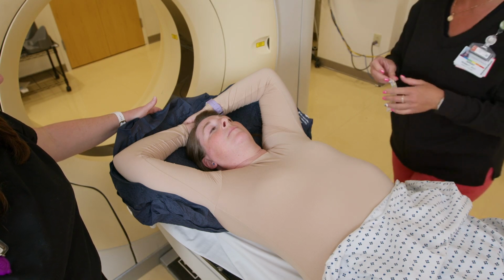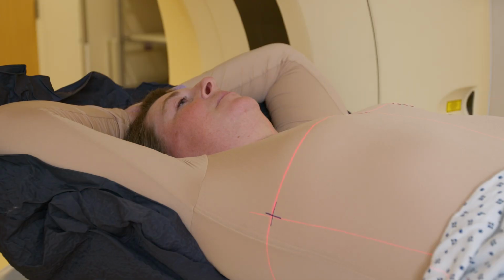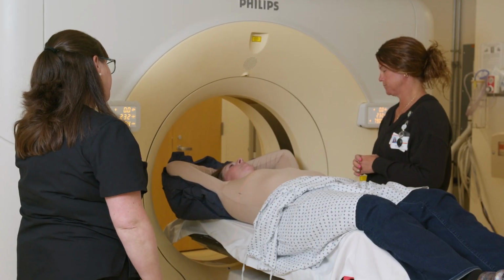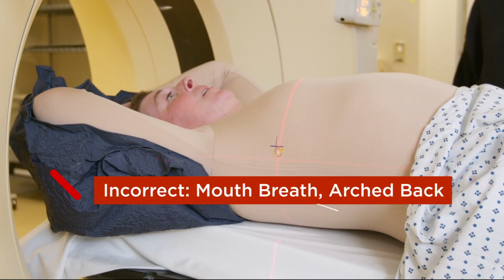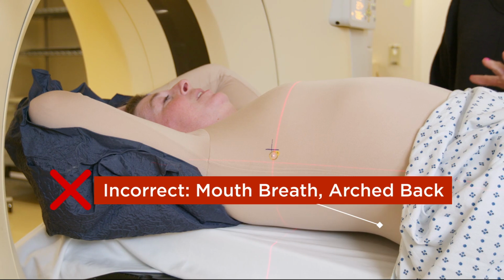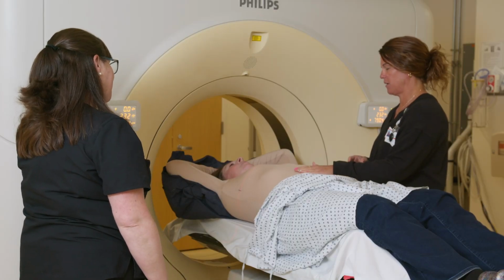Once you're in the best position for your body, you'll be coached on the breath hold technique. We'll start with a little practice. You'll be guided to take a deep breath in through the nose and hold without arching your back. Our goal is for you to fill your lungs as opposed to taking a belly breath. We'll ask you to hold this breath for 30 seconds. Keep in mind to take in an amount of air that you could repeat multiple times without arching your back.